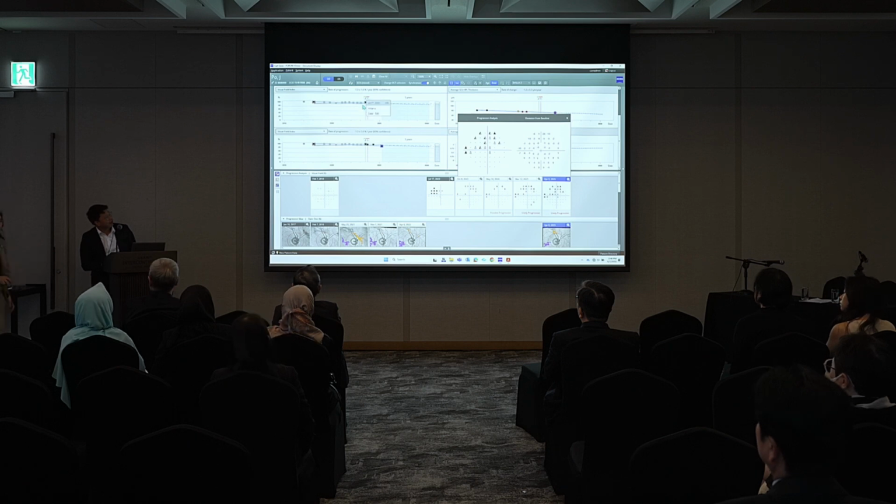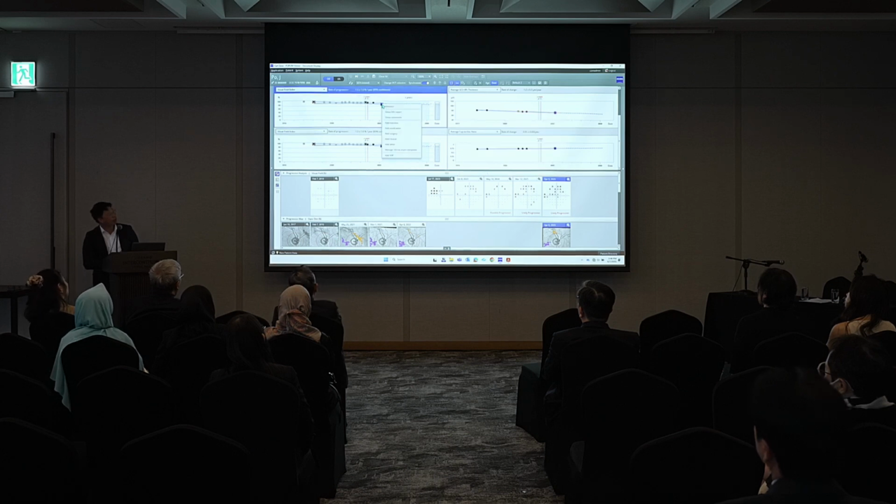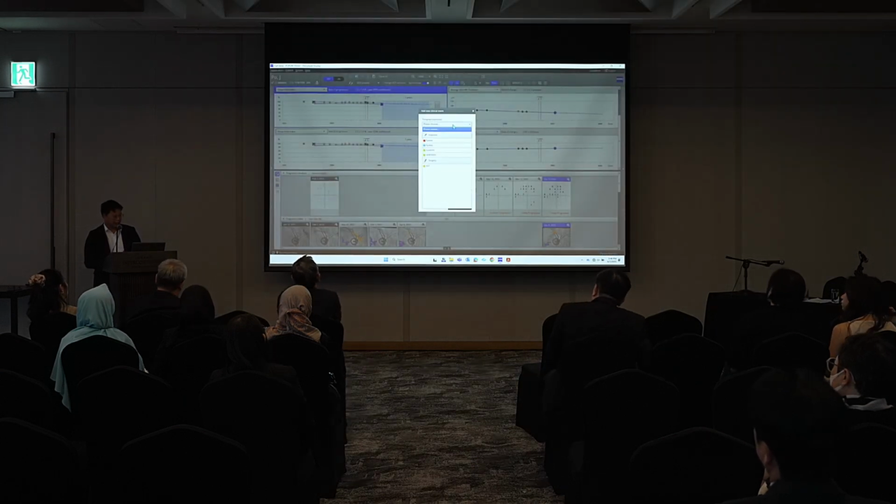Yes, so here I've actually demonstrated it, and thanks, because I know our retina colleagues kindly demonstrated that. But here, this patient's had surgery at this point, right? So if you right click on any visit, I'm not going to add an injection, because it's my glaucoma clinic, but here we can right click, we can add our surgery, and here you can see there are different templates available if you've pre-made them.